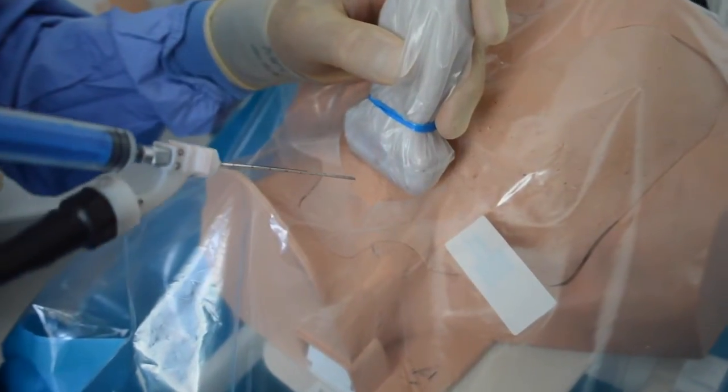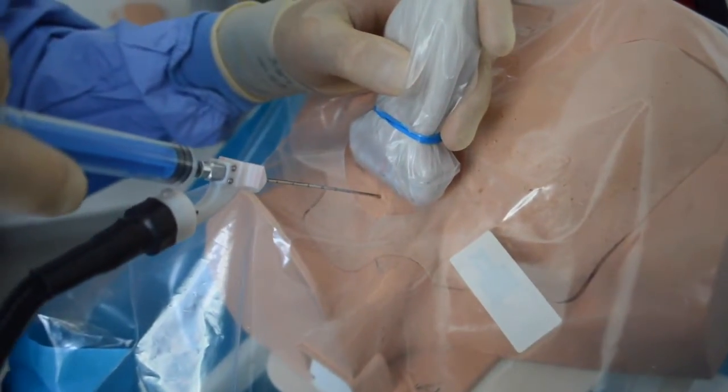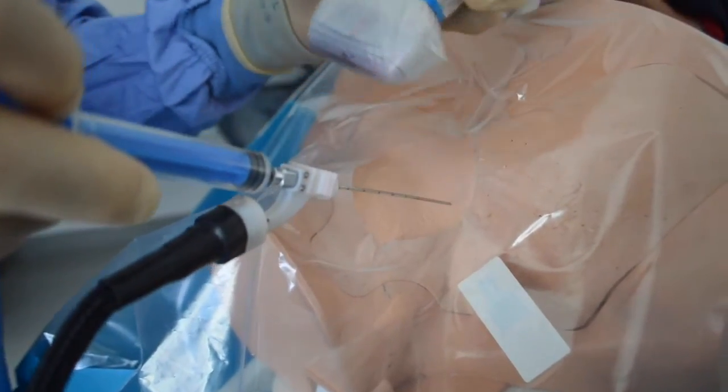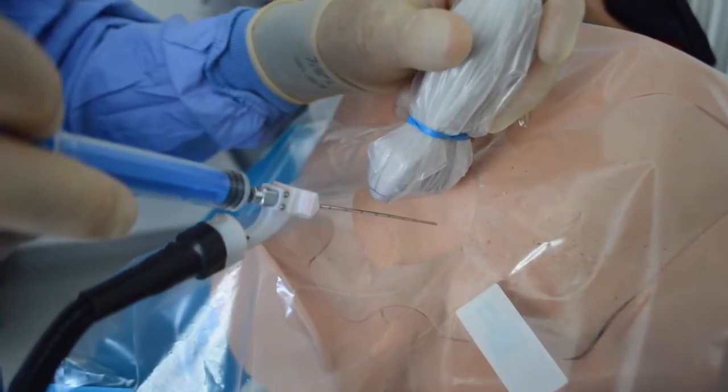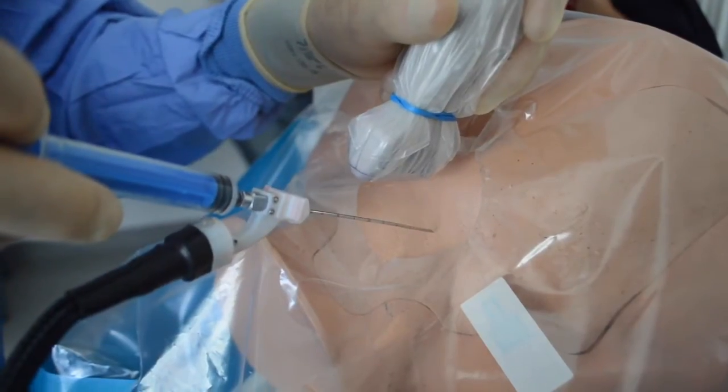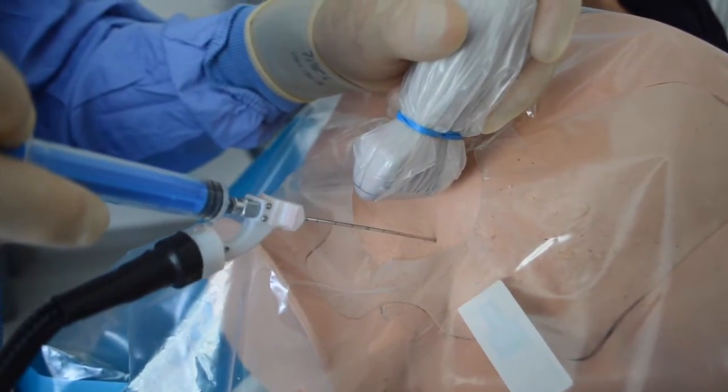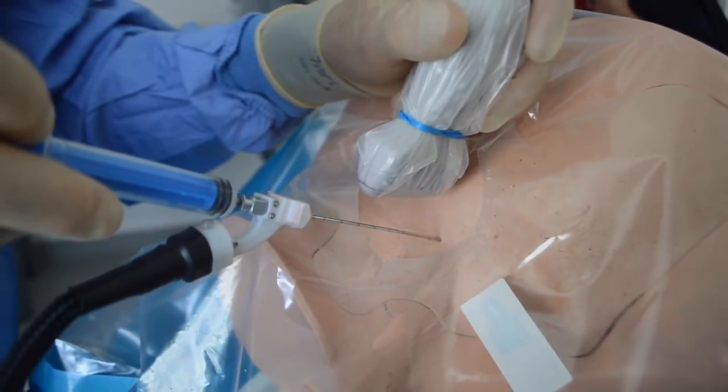Here we are looking at both the vessel and the needle in the short axis. If you orient the probe this way, the needle and the vessel are parallel, so it would be in-plane for the vessel and long axis or in-plane for the needle.